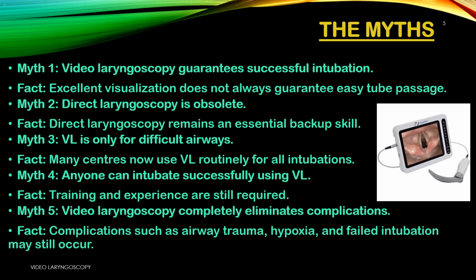The myths. 1. Myth: Video laryngoscopy guarantees successful intubation. Fact: Excellent visualization does not always guarantee easy tube passage. 2. Myth: Direct laryngoscopy is obsolete. Fact: Direct laryngoscopy remains an essential backup skill.